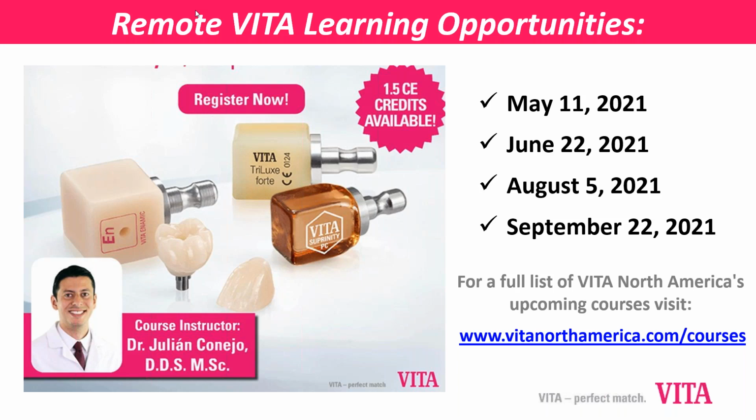HT is nice for veneers in younger patients with more ideal clinical situations, or maybe partial coverage of the posteriors like inlays. It blends very nicely for crowns, and in general I prefer the T.